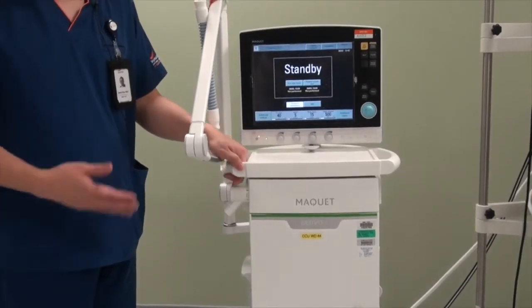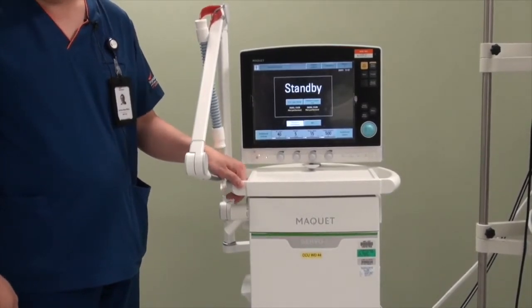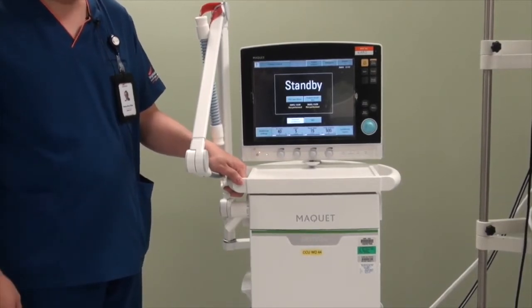Today we will be demonstrating how to set up the Servo-i for patients on mechanical ventilation. I would like to start off by going through some of the external features of this ventilator.